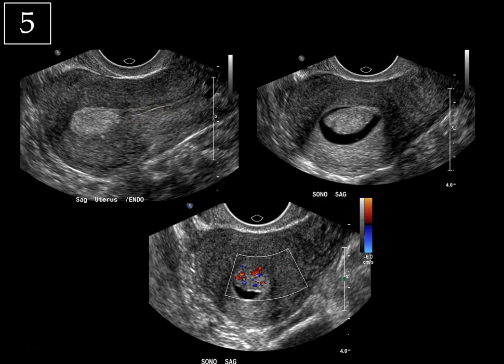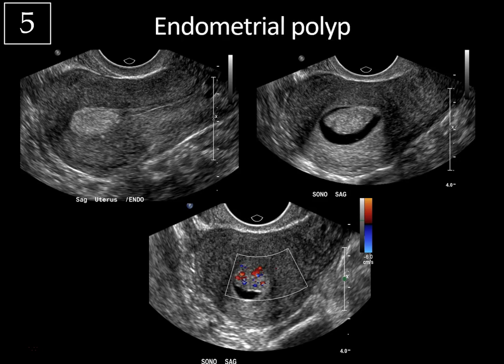The best modality to evaluate the endometrium is with sonohysterography, where saline is instilled into the endometrial cavity distending it. You can see that saline is causing the sound waves to speed up, causing increased through transmission posteriorly. The fluid is nicely outlining this homogeneous echogenic polypoid mass, which is clearly arising from the anterior endometrium. When we add color Doppler imaging, you can see a vascular stalk leading to this lesion with diffuse vascular flow, and this is typical for an endometrial polyp. A submucosal fibroid can sometimes appear similar, but it will tend to have less vascularity and will also have posterior acoustic shadowing.